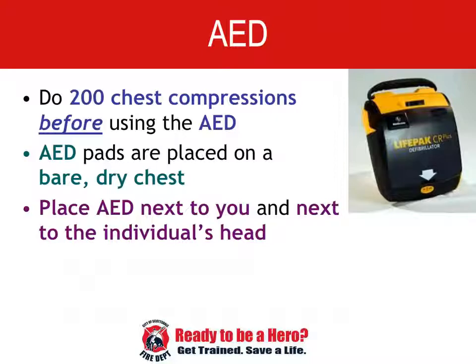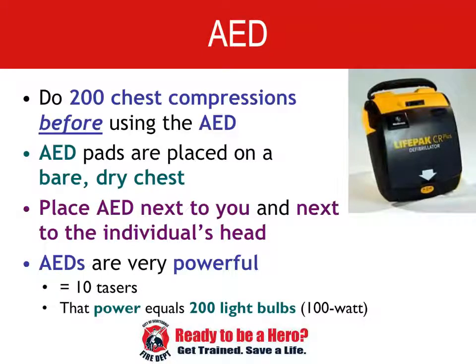Do not touch the patient. If you are touching the patient when the AED shocks, you will get shocked too. The AED has the power of 10 tasers. It will stop your heart. It is very important that no one touch the patient when it says it's going to shock. The machine will shock, pause, then tell you to begin CPR again if necessary.